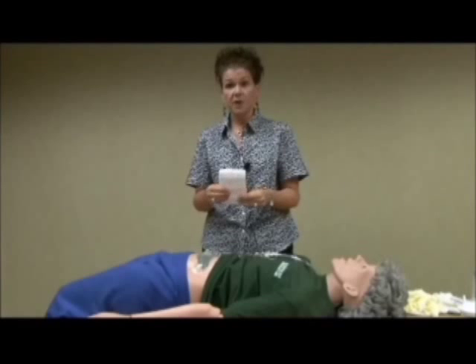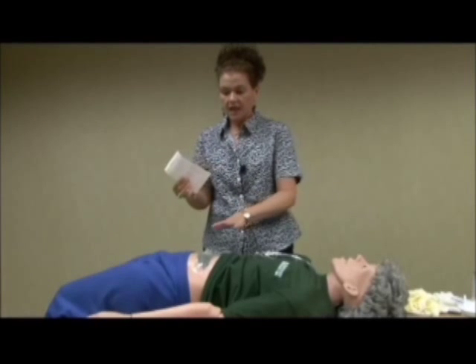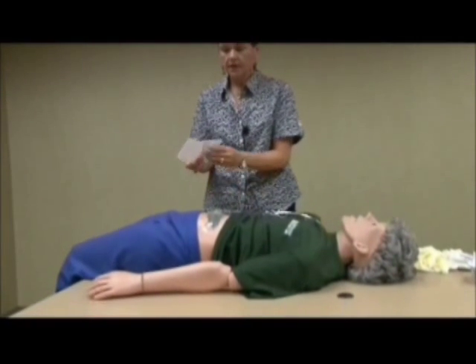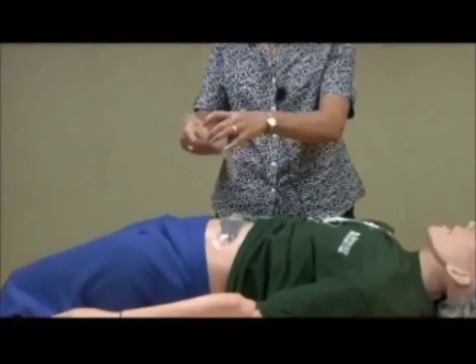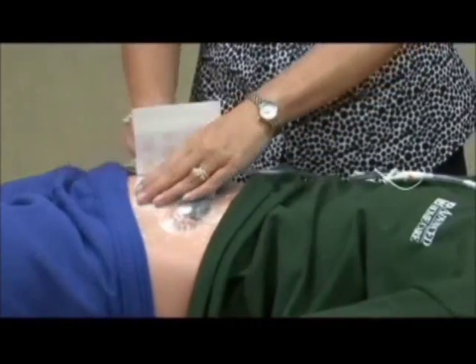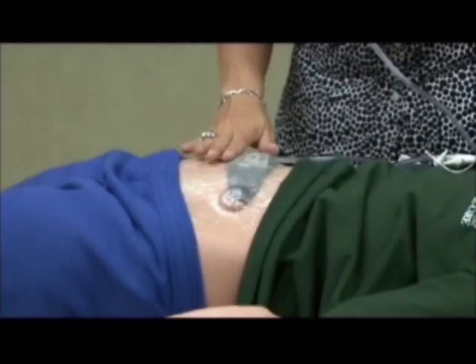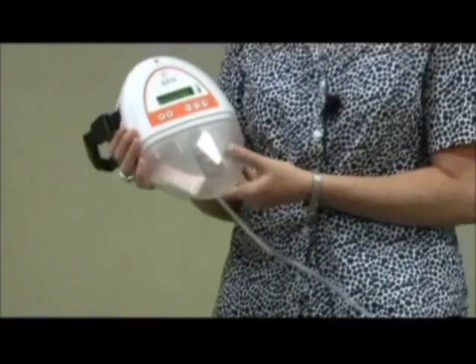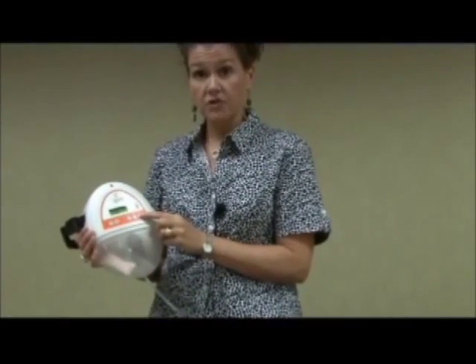You'll want to cut a small piece of the adhesive drape from your medical supplies and determine on your dressing where you may have a leak. By removing the backing from the adhesive drape, you will then place a patch over your dressing. Once you've repatched your dressing, restart your negative pressure wound therapy machine by pressing the button furthest to the right.